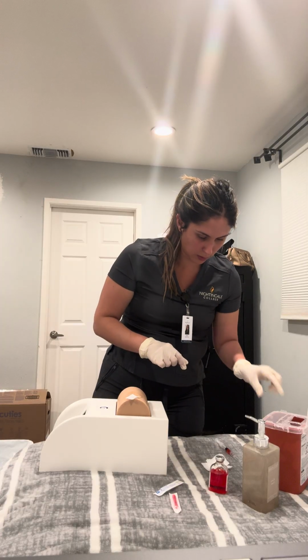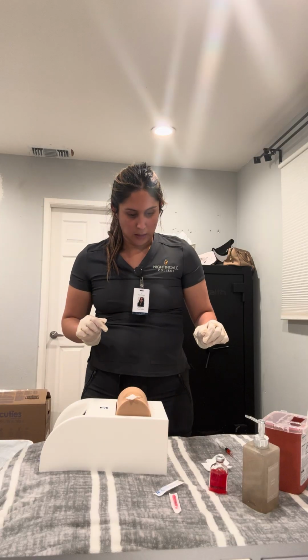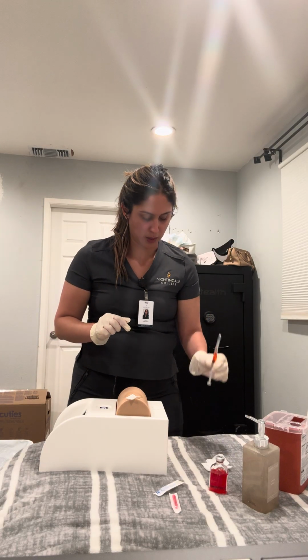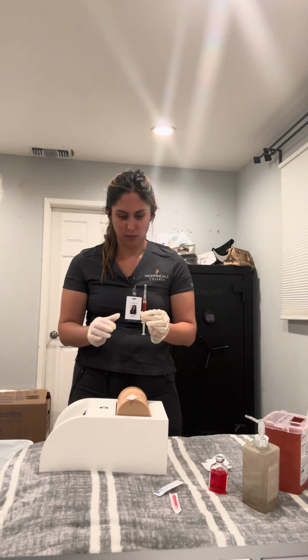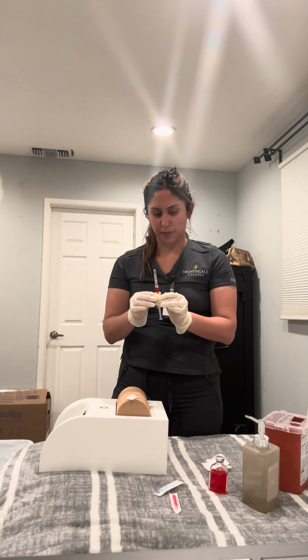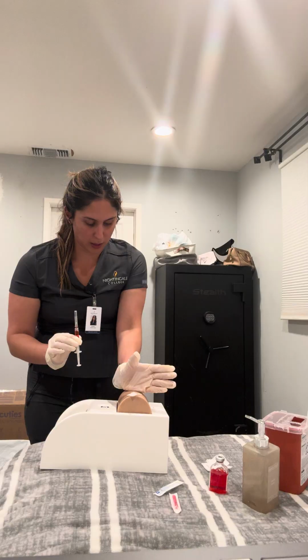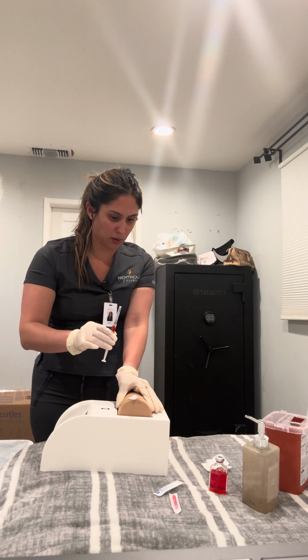And then I'm going to grab my needle and grab my patient like this, where I'm comfortable.